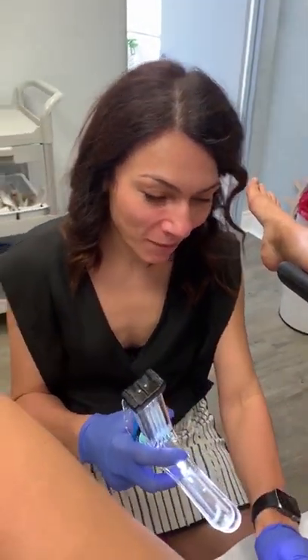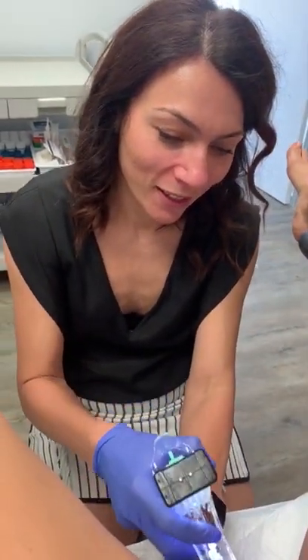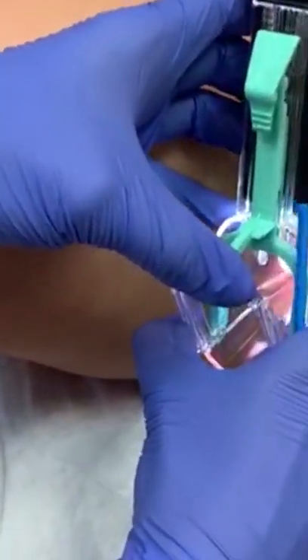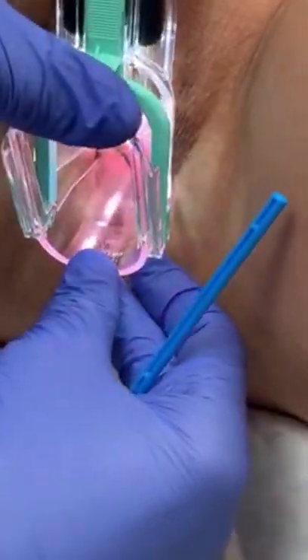I'm doing a Pap smear on one of my patients. I'm inserting the speculum inside the vagina and seeing the cervix, opening up. Here's a brush to take cells from inside of the cervix and cervical canal.